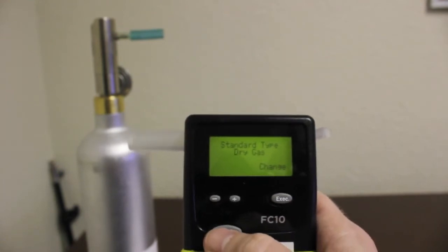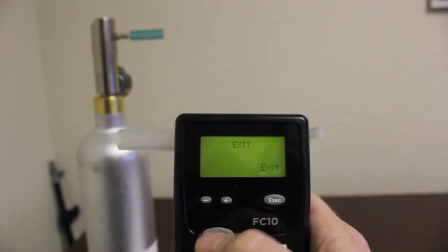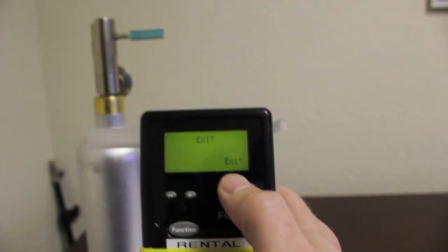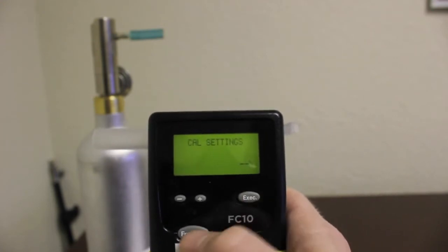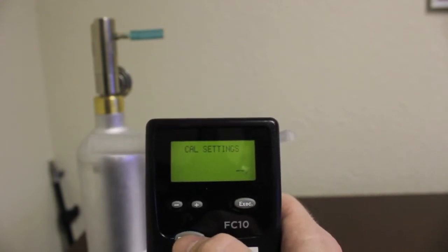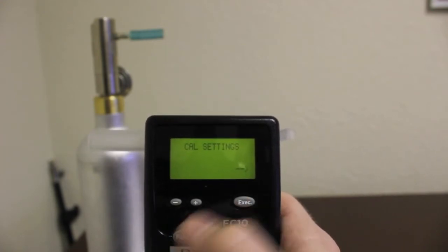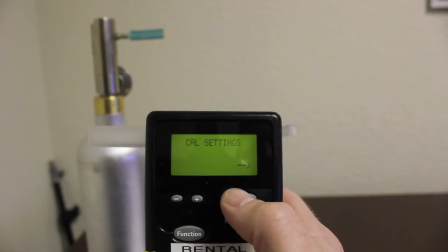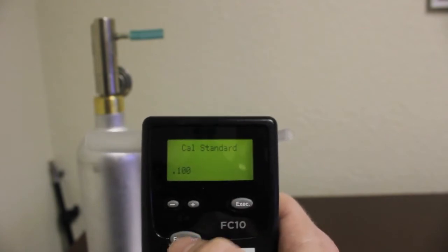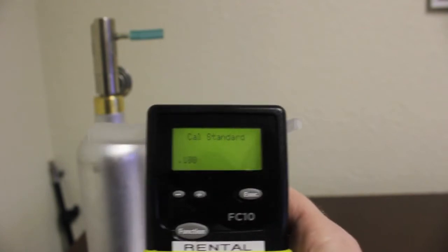Press the Function button to reach the Exit screen and press the Execute button to exit back to the Cal Settings screen. Press the Execute button to reach the Cal Standard screen.